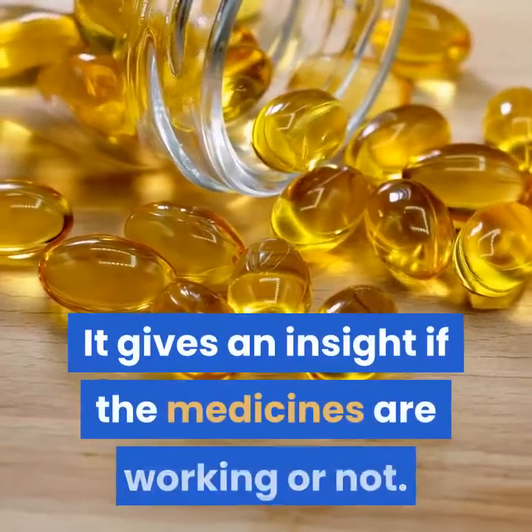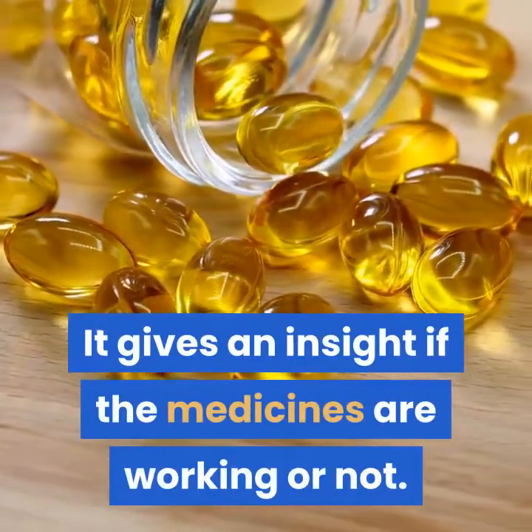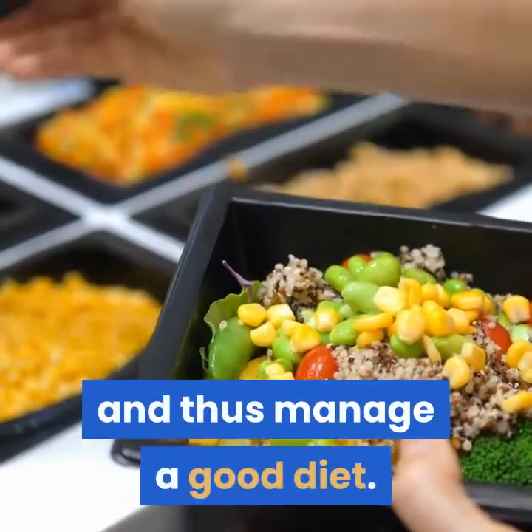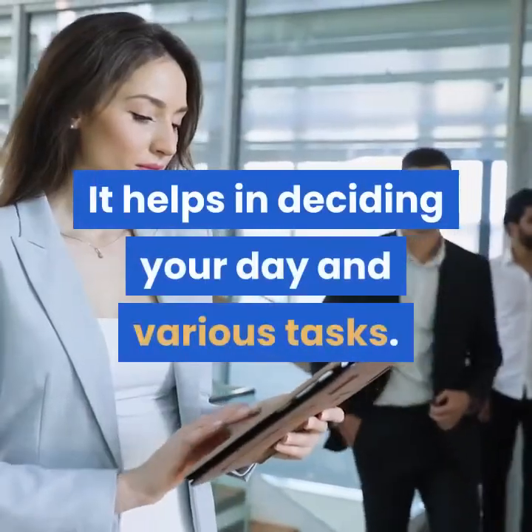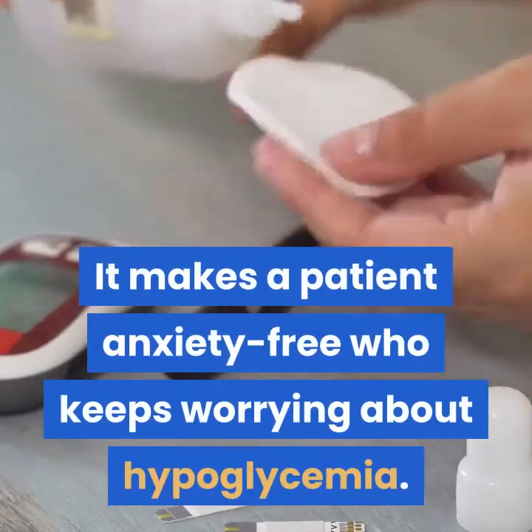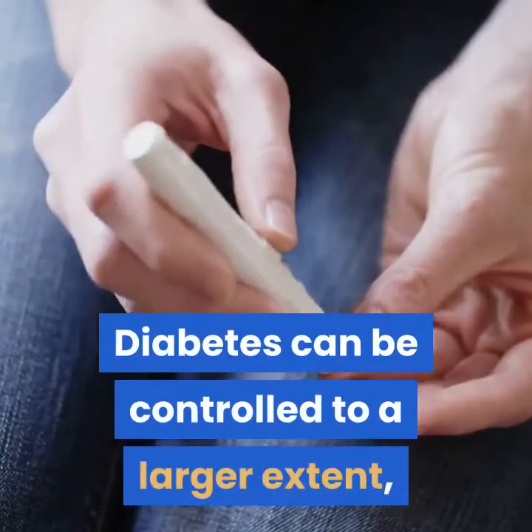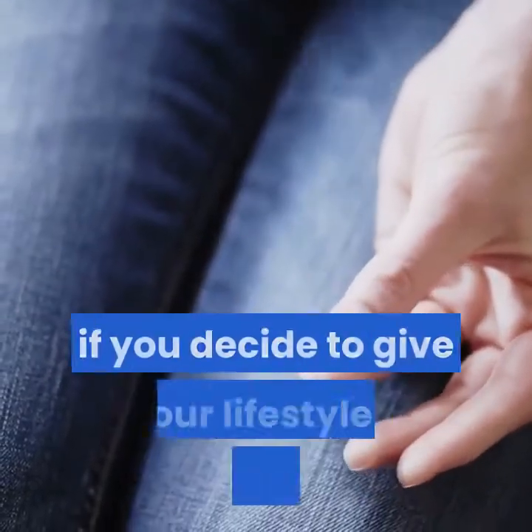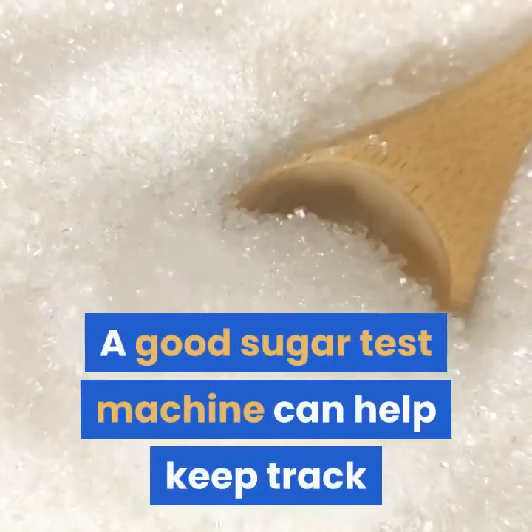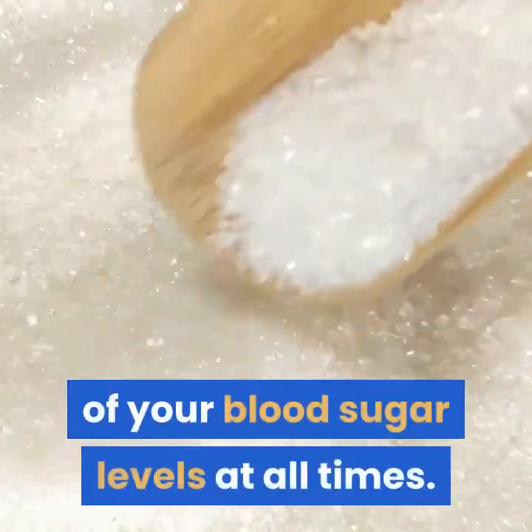It gives an insight into whether the medicines are working or not. You can learn about the foods that need to be controlled and manage a good diet. It helps in planning your day and various tasks. It makes a patient anxiety-free by addressing concerns about hypoglycemia. Diabetes can be controlled to a larger extent if you decide to give your lifestyle a proper check. A good sugar test machine can help keep track of your blood sugar levels at all times.